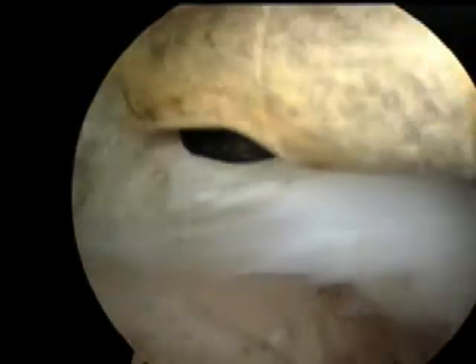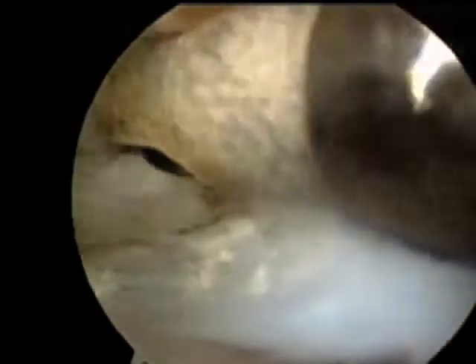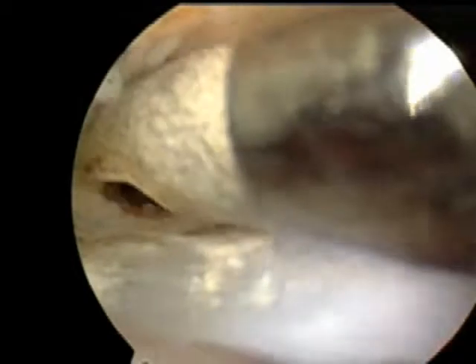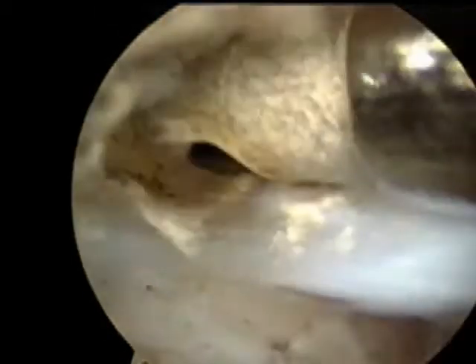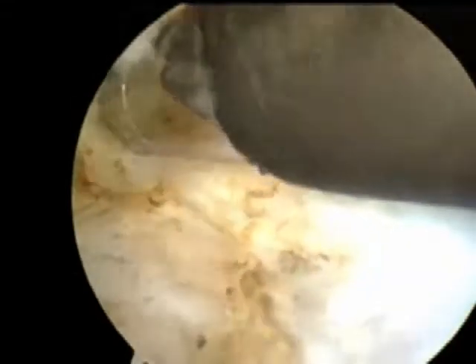This is an arthroscopic video of a canine stifle joint that has a medial meniscal tear and we're performing the partial meniscectomy. We're removing that torn portion from the joint, and here we're using a radio frequency device that actually vaporizes tissue.